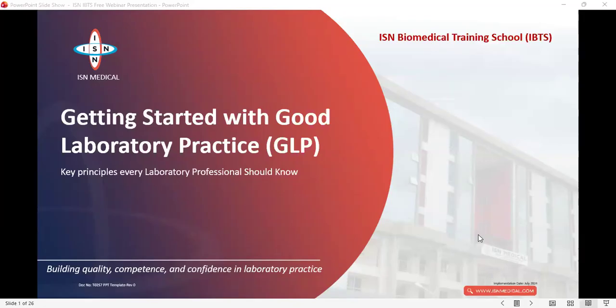Imagine what happens to the sodium, chloride and potassium of that particular serum sample you want to use to run the electrolyte testing. It will be elevated. Your result is technically correct, but because of the pre-analytical condition, that result has been invalidated. Do you understand what I'm saying? Yes, ma'am. So, Rufus, you can go ahead.